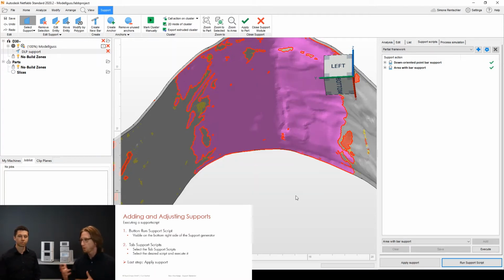I just do not want to show the script here because actually our next step would be how to edit or to add a single support in there. Maybe one information at the end: any change you perform in the support generator, you have to apply at the end in order to go back to the machine environment.